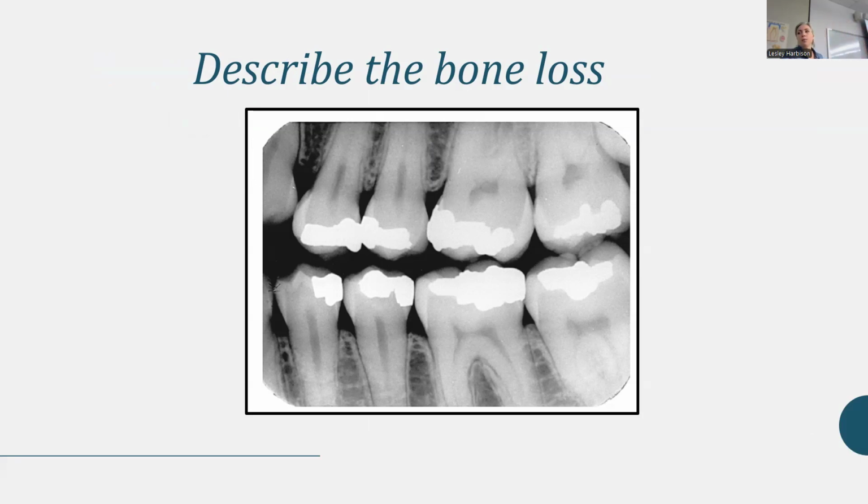So what I would probably do is look at the lamina dura and say it's really close in general. Yes, there's a little widening here, but maybe they hit heavy. Maybe there's a parafunctional activity. In this class, I don't want you to overdiagnose.